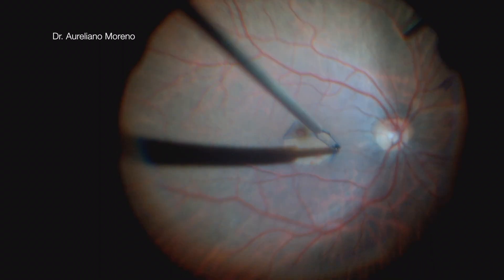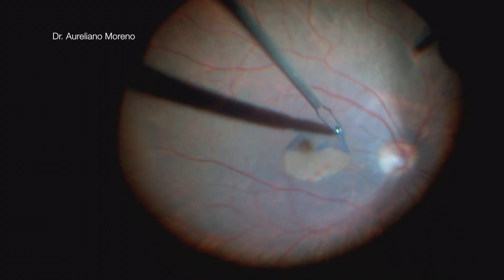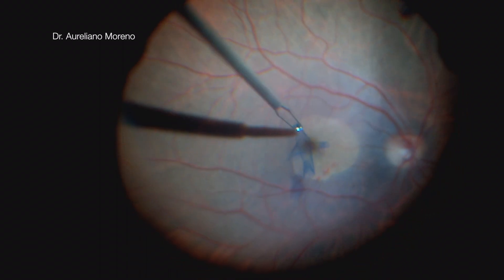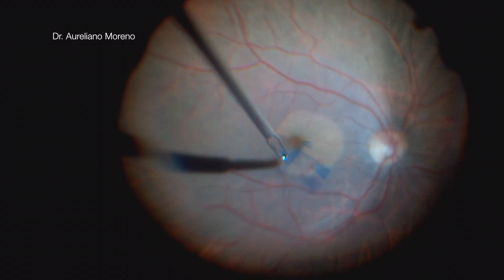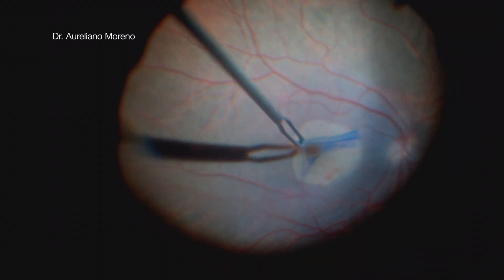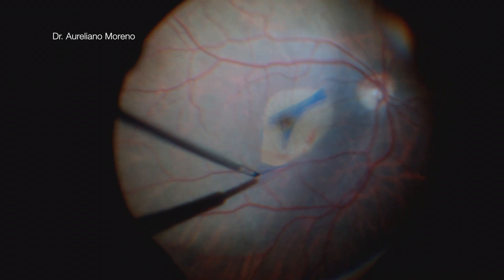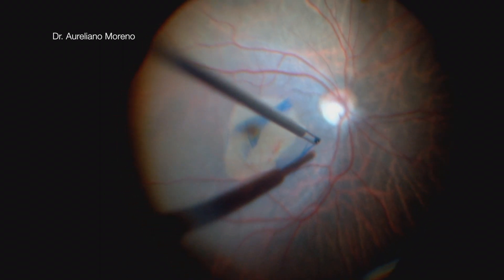The first thing I do is conserve the flap around the macular hole. It's important to make sure that the flap is attached to the edge of the macular hole only. After that, I enlarge the limitanorexis a bit.